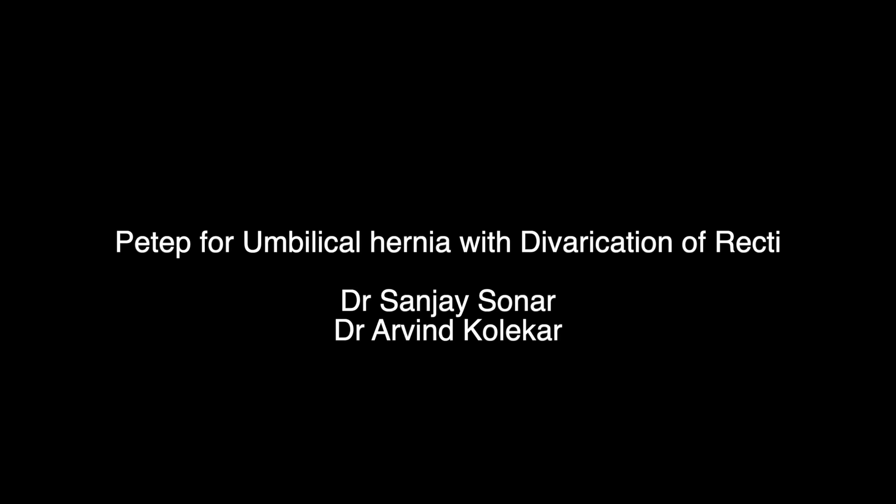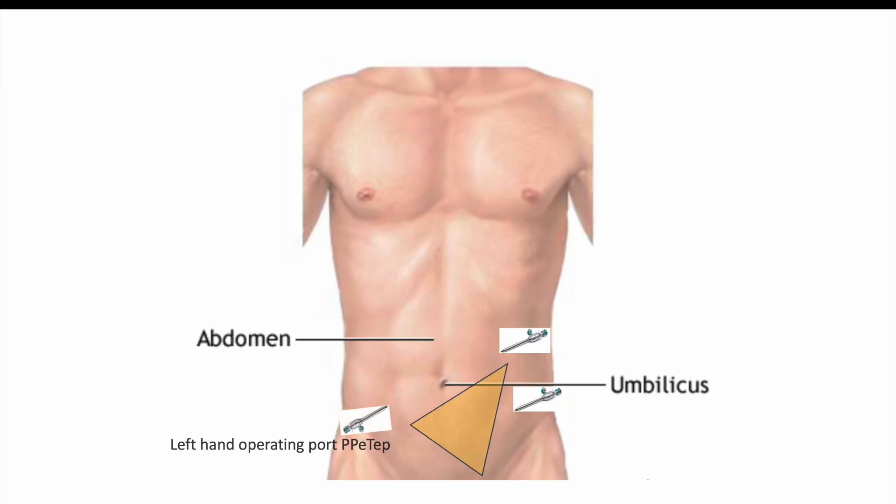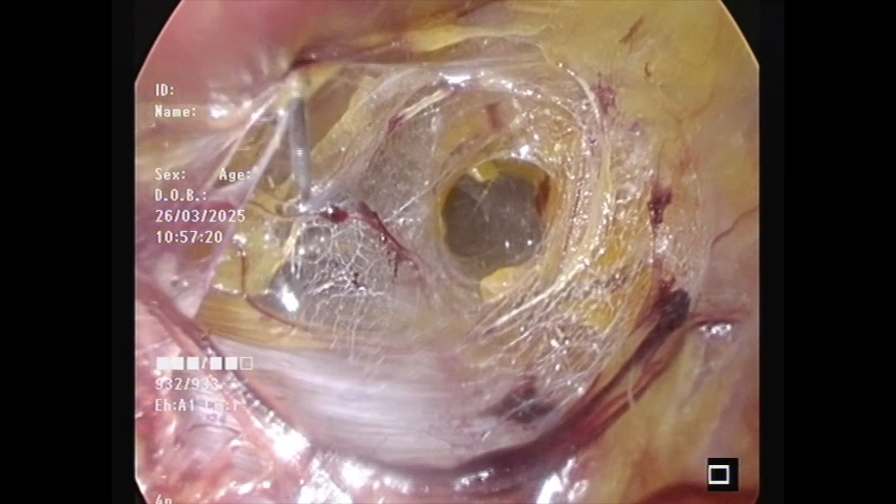This is a case of preperitoneal repair of an umbilical hernia with divarication using the ETEP approach. You can see in the visuals the ETEP port is taken, the Stoppa plane is dissected, and three ports are inserted in the Stoppa plane.